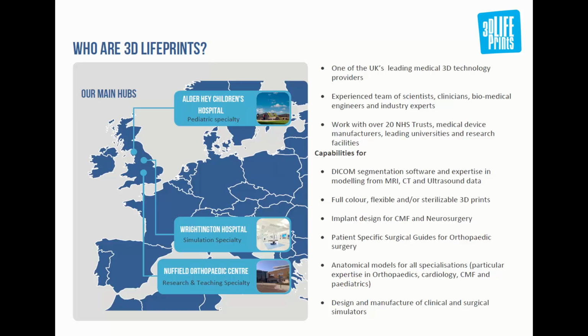We currently work with over 20 hospitals around the country. We work also with many medical device manufacturers and leading universities and research facilities, in essence, to produce anything in the medical sphere that involves anatomy, 3D printing, prototyping, and design.